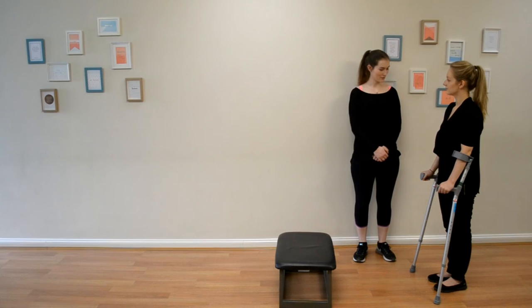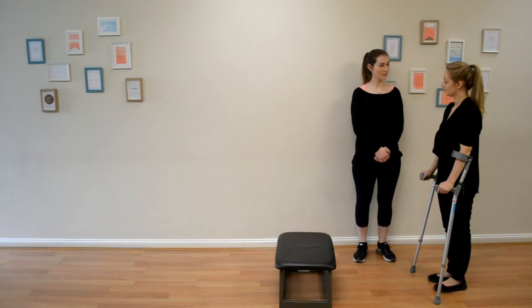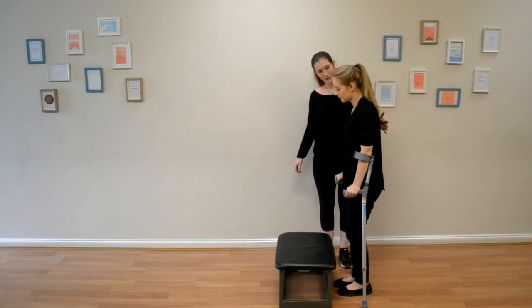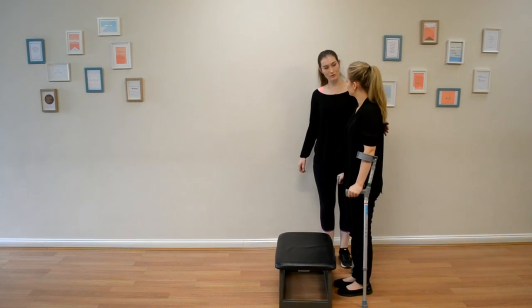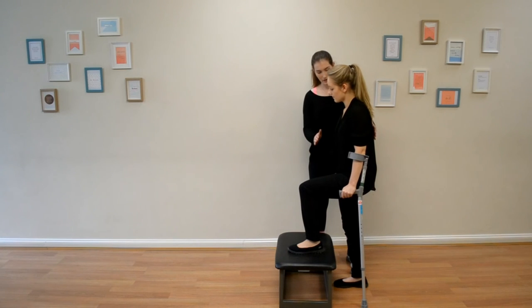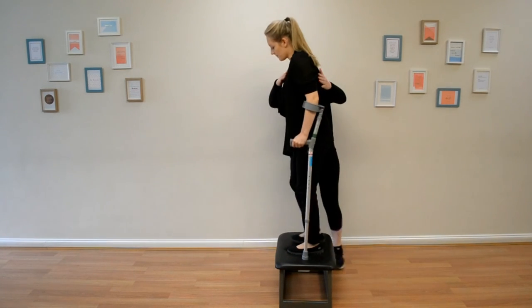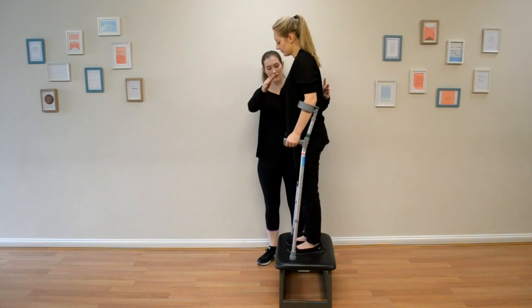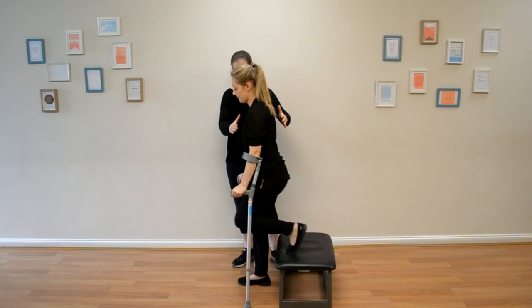Alex has stairs at home so needs to know how to use her crutches to get up them. Alex has hurt her right knee — that will be the bad knee throughout. Walk up close to the step using your crutches, then step up first with your good leg. Push through that leg, then push up with the other leg and stand on the step with your crutches. To step down: first put your crutches down, then your bad leg, then your good leg — so crutches, right leg, then left leg.